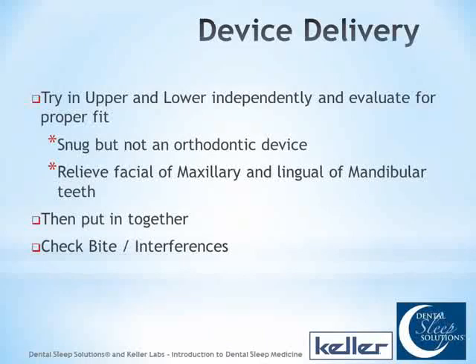Say you have one of the incisors down on the bottom that's pushed back towards the tongue. We just go ahead and adjust that, because those are the force vectors, and that's what's acting on those teeth when they put these devices in and they sleep with them. So adjust those types of things and check the bite, make sure everything else looks good, and then go over what you expect them to do and how they wear it and the home care instructions and all of those types of things. And we'll get into that a little bit more next time when we do the patient protocols.